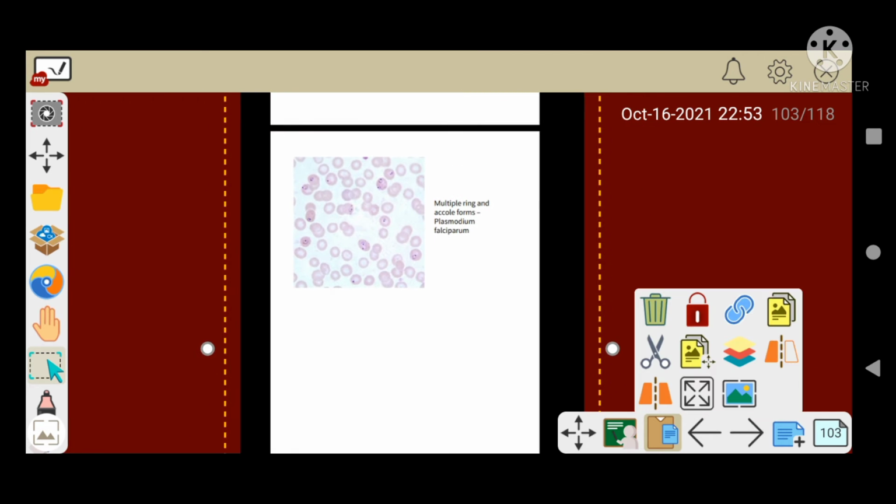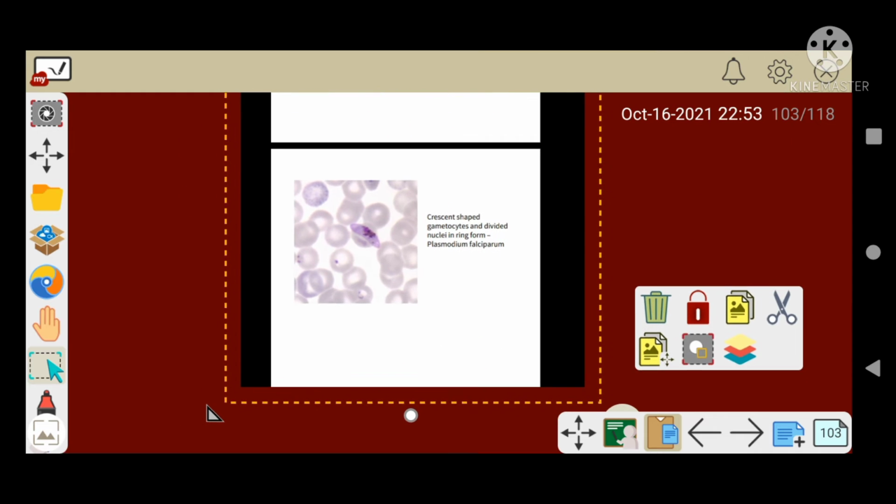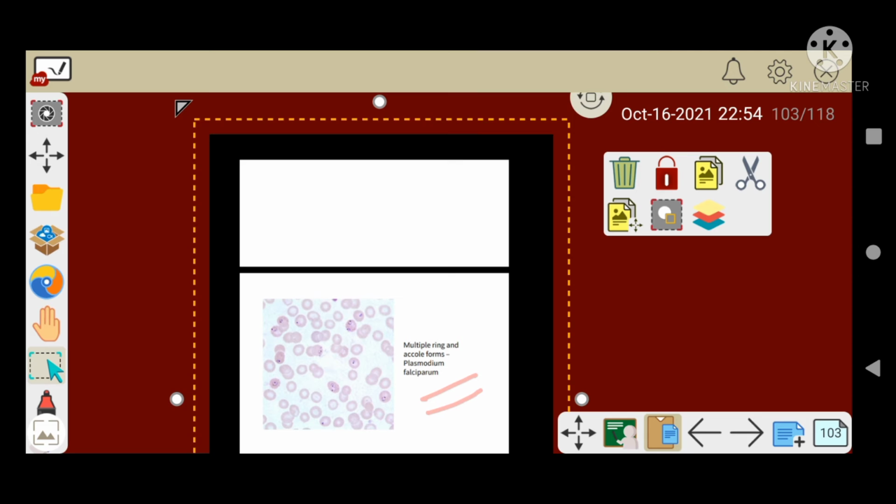Okay, what is this? Yeah, this is important and this has been asked. So let me discuss this. See, these are Plasmodium falciparum. Whenever in a cell you see more than 2 dots, it is 2 or more than 2, mostly 2, it is Plasmodium falciparum. Else you can see a banana shaped gametocyte. Anything of the two, Plasmodium falciparum, right? This is the same Plasmodium falciparum, this is also Plasmodium falciparum. Where is Plasmodium vivax? I will show you.